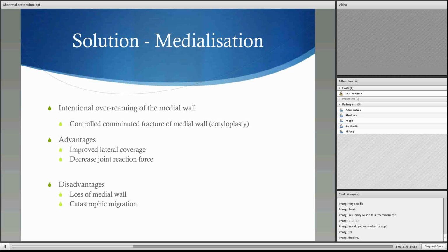How do you decide whether it's bone graft or not? My understanding is, it should be less than 40% of the cup being uncovered. We're talking mainly about the Crowe 2 and Crowe 3 reconstruction, to get a good press fit of the component.